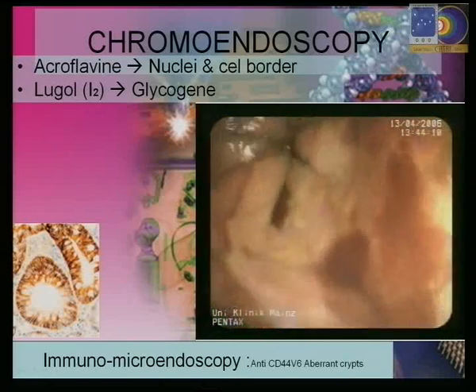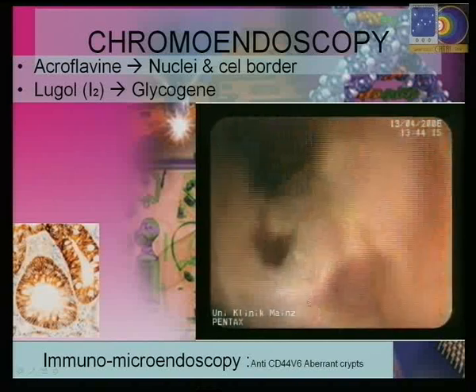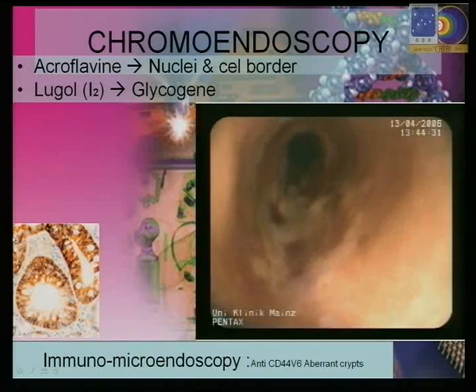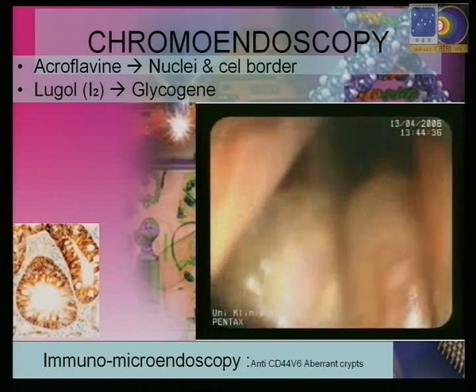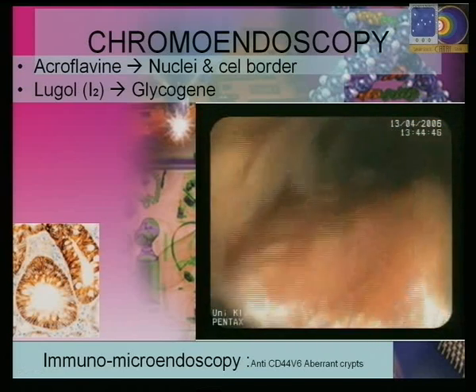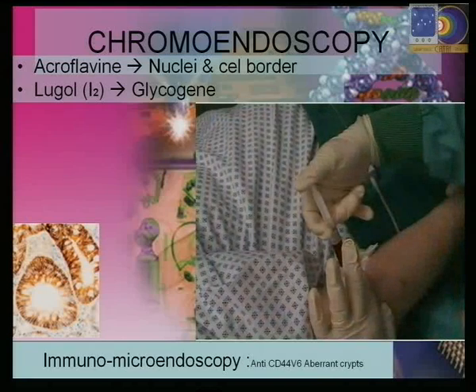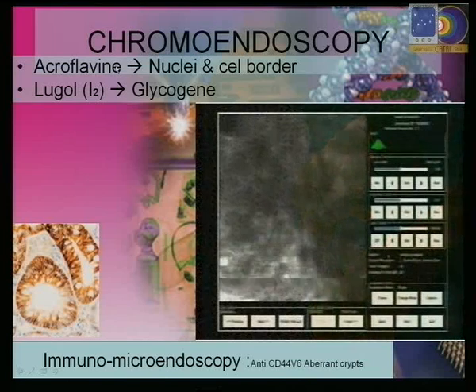A large area of unstained mucosa becomes visible after intravital staining. The borders between the suspected neoplastic lesion and the normal squamous epithelium can be easily identified. Chromoendoscopy is used to unmask the area of interest. Subsequently, targeted endomicroscopy can be performed. The endomicroscopic window is positioned in the lower left corner within the endoscopic field of view. Images can be obtained following gentle contact and pressure with the endomicroscopic window at the mucosal surface. Fluorescein is injected as a contrast agent for endomicroscopy.